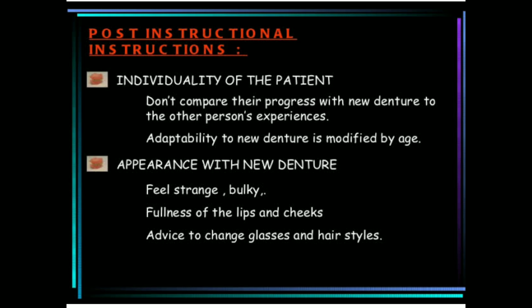Depending upon their individual condition, the denture objectives, I mean retention, stability, support, and aesthetics, change. So never ask the patient to compare their new denture with another person's, right? As I said, it always differs. And in appearance with the new denture, they might feel it is strange, bulky, with fullness of the lips and cheeks. They will feel they have to change their hairstyles and everything.